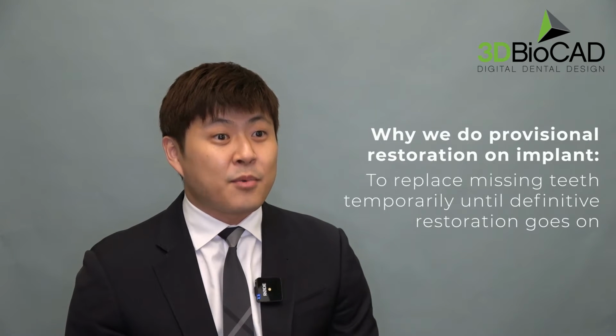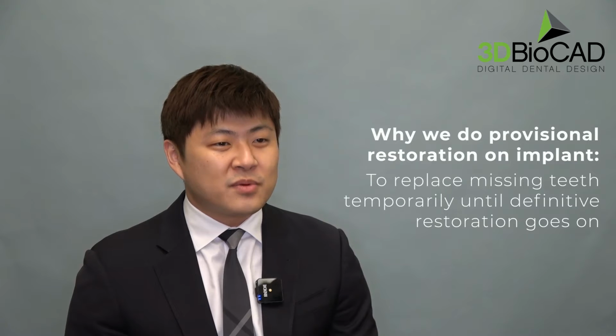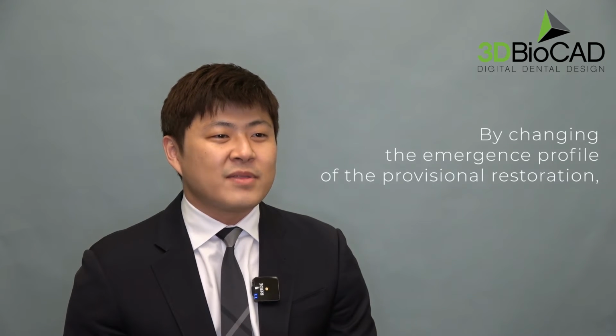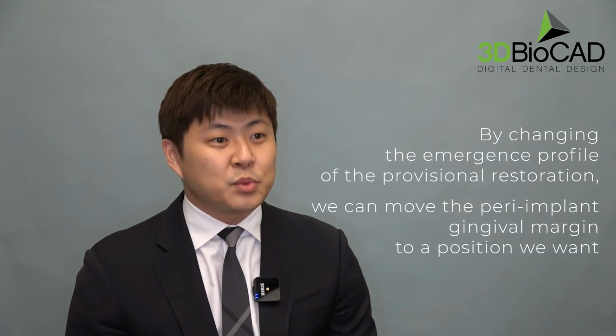My tip for you today is about digitally transferring the emergence profile of an implant-supported provisional restoration to the lab. One other reason why we do provisional restorations on implant is, of course, to replace missing teeth temporarily until the definitive restoration goes on. But the main reason why we do provisional restorations on implant is to shape and contour the peri-implant soft tissue. By changing the emergence profile of the provisional restoration, we can move the peri-implant gingival margin to a position we want.